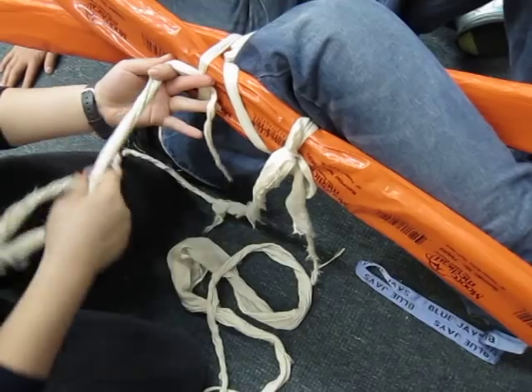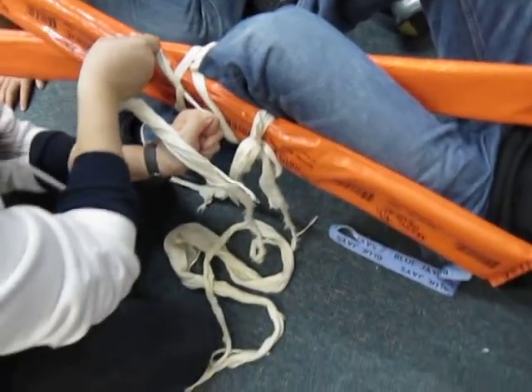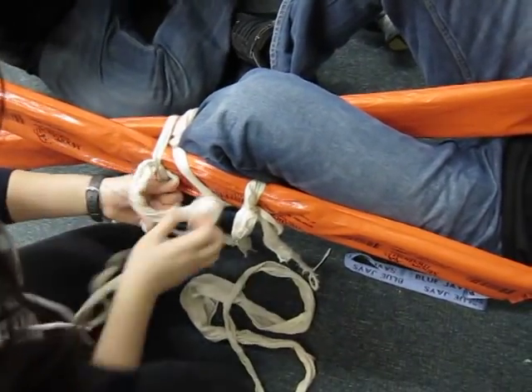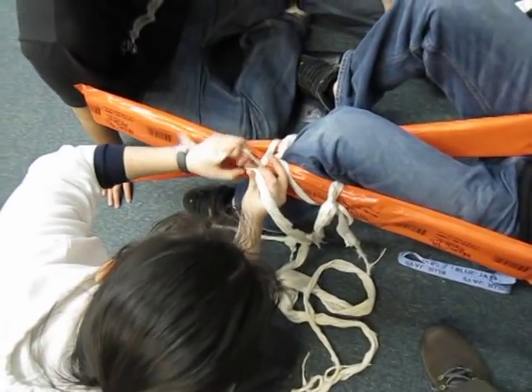It's just the normal — there's a cross underneath. Can I give myself enough slack here? This is really tight. I didn't leave myself enough space. I don't want to lift this facade here. But that's another day as well.